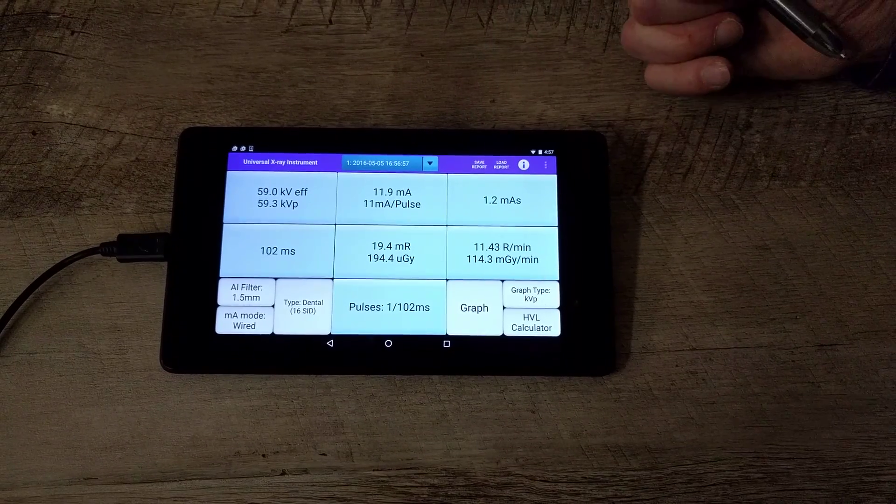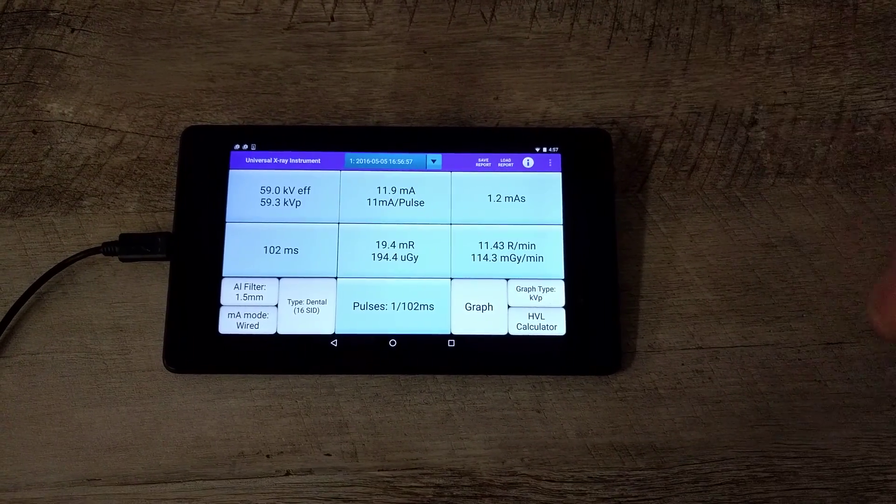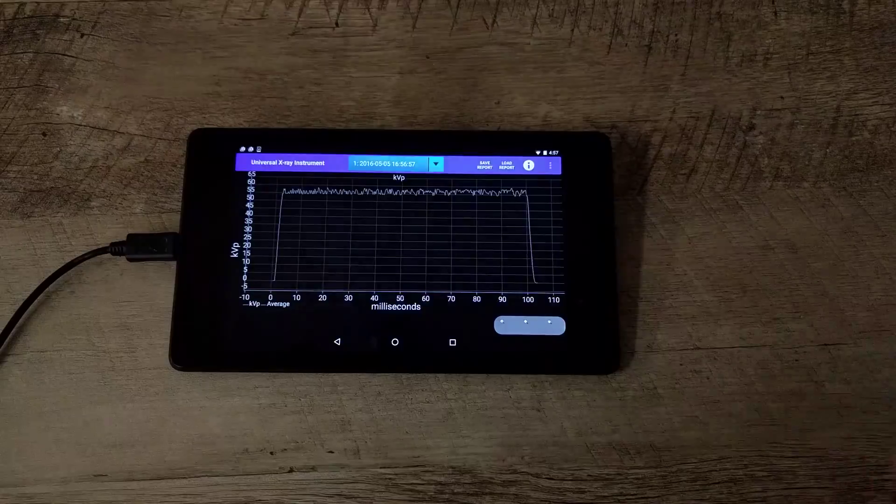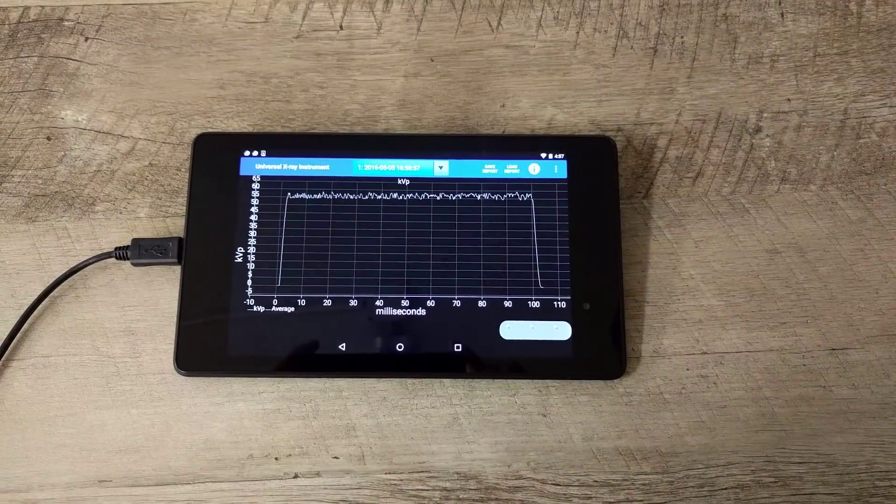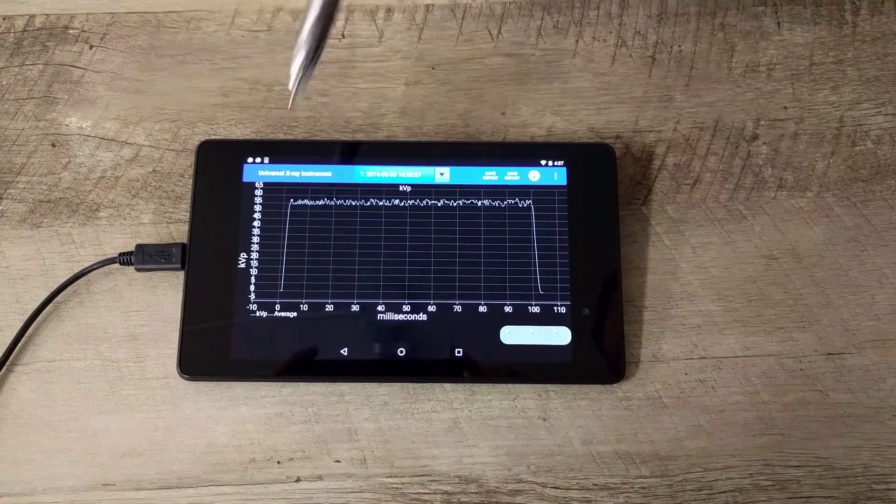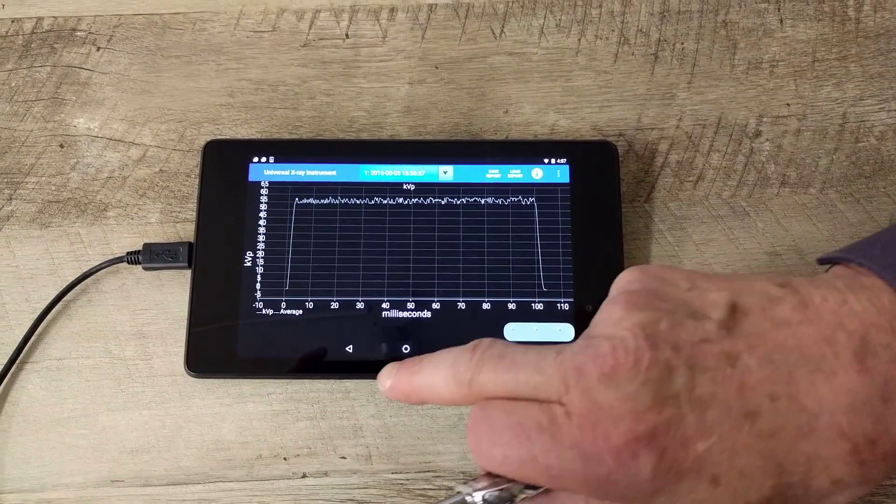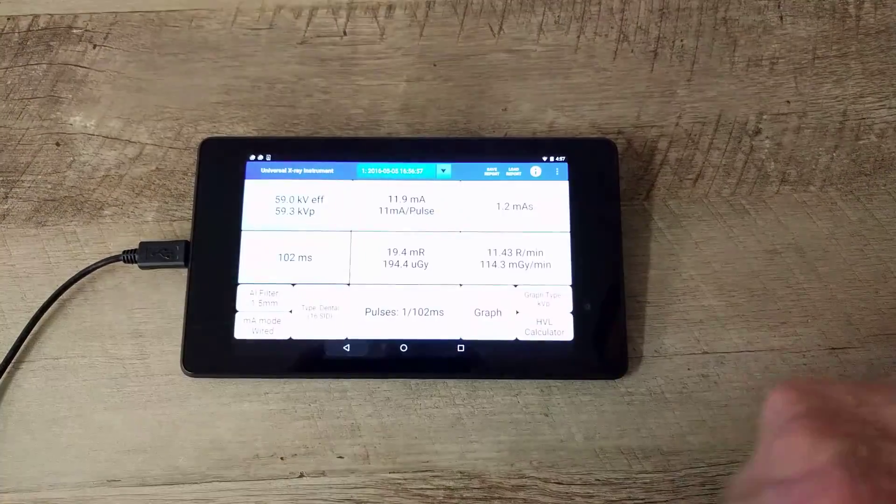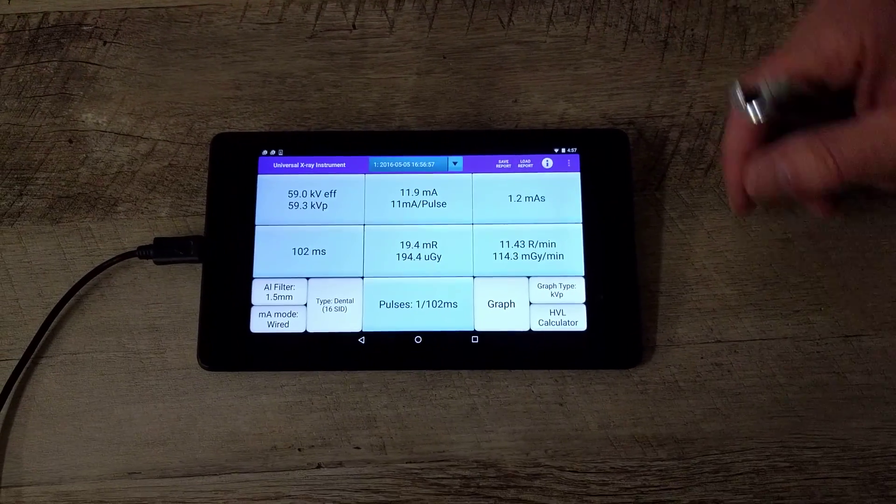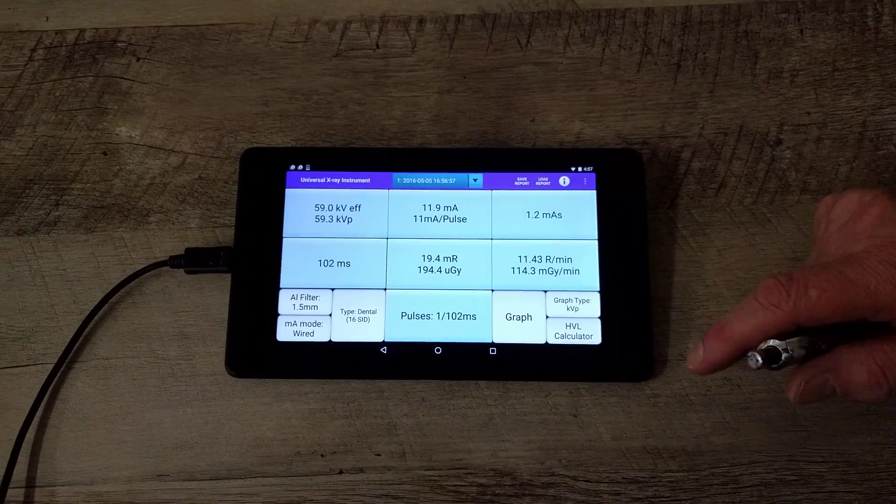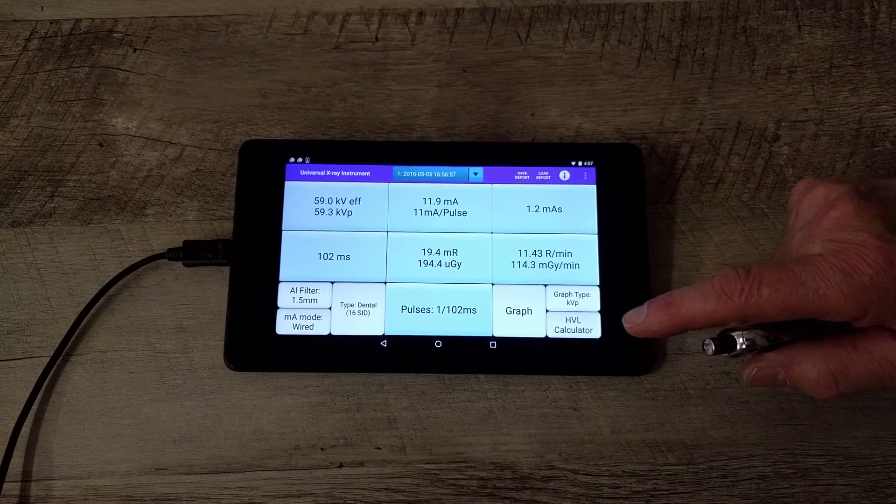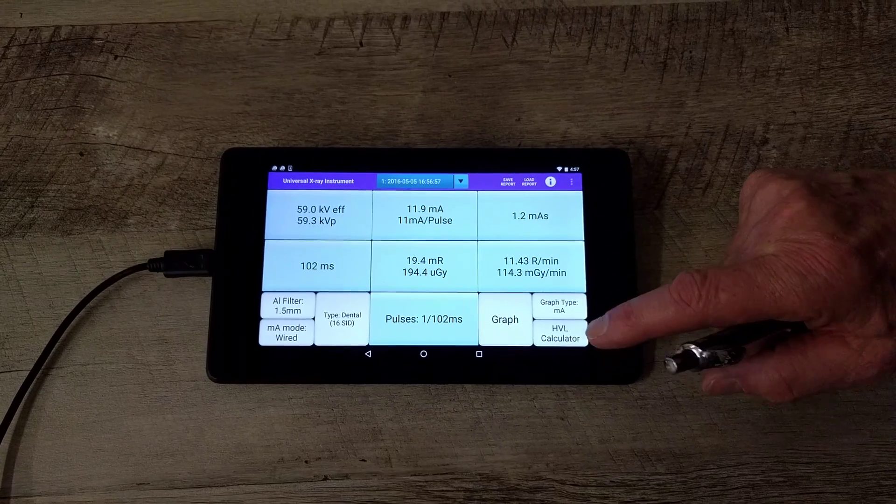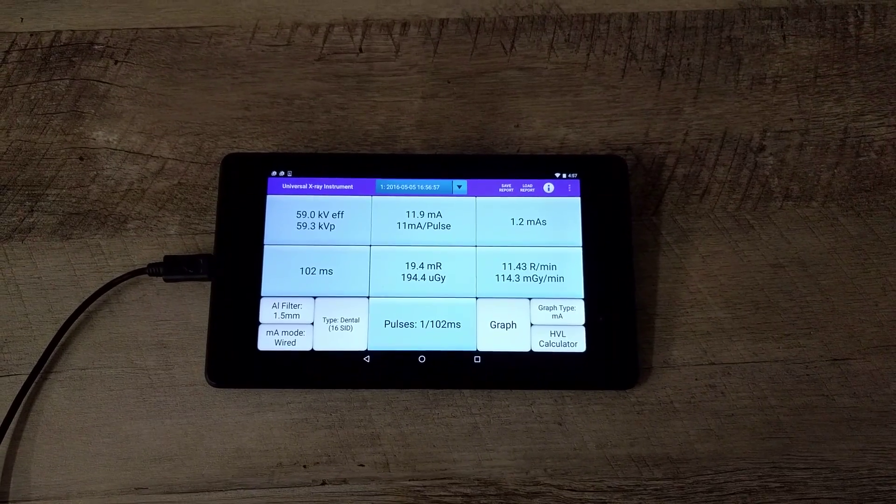Look at the graph, you just tap the graph button and you can see a graph of the kV. I will take another X-ray. I'm going to change the time and the kV. Let's move the graph to MA. Let's look at the milliamp graph.